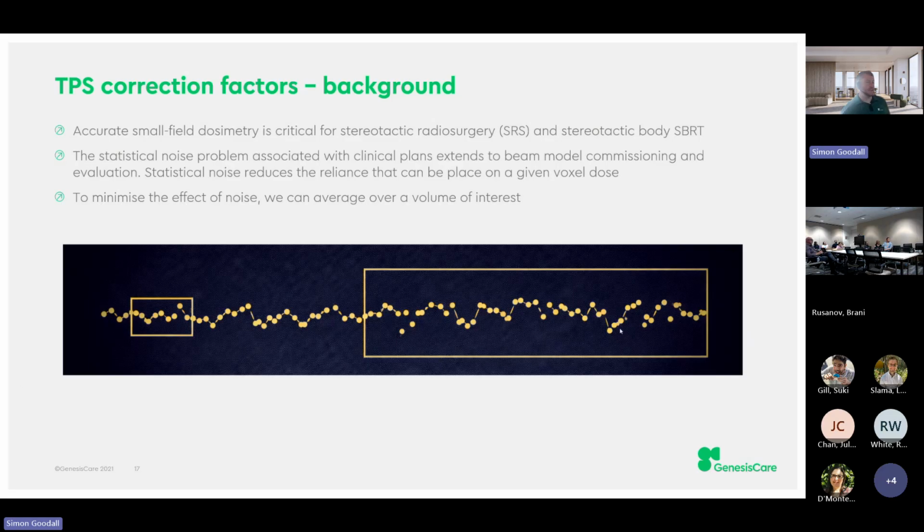So this is, I guess, a very rough sketch. If you can imagine some kind of standard line here, which has a bit of noise going across the screen. What we want to do to try and determine the mean value of that line is to take an average over a small volume, so that we don't just get a number that's quite so affected by the noise. Now, in a small field, we need to take a small volume to be able to determine an average, but that means we're still a bit more susceptible to noise interactions.